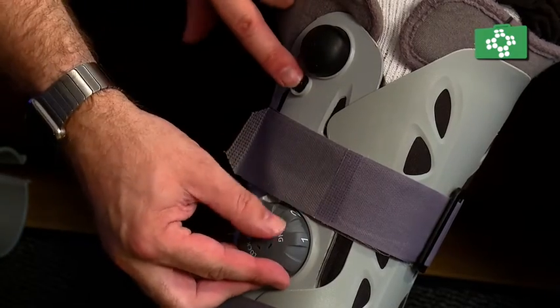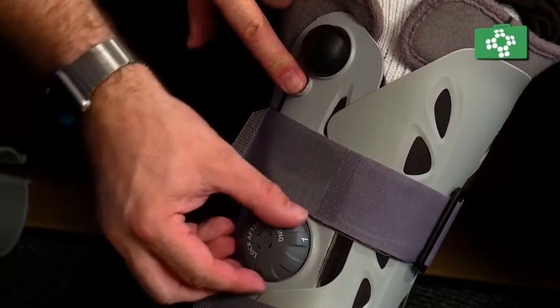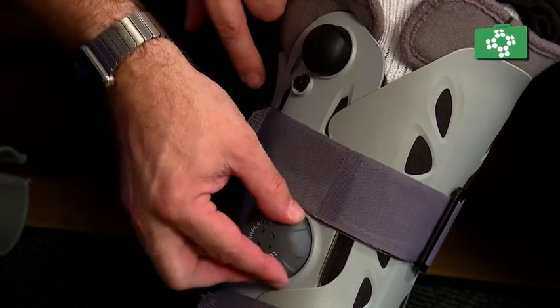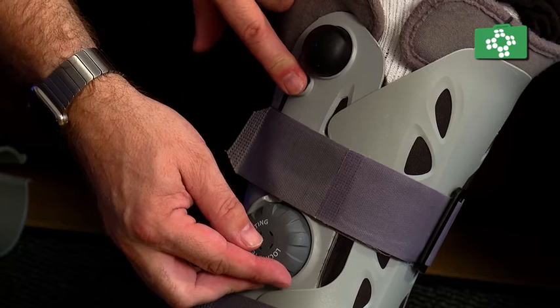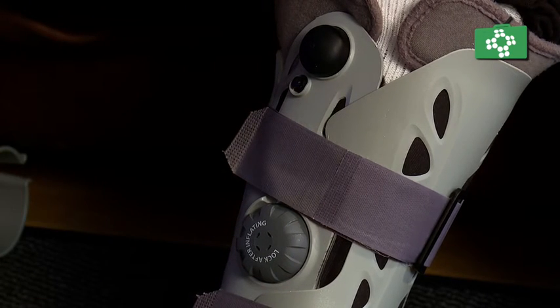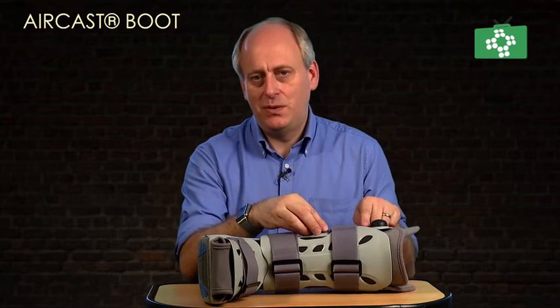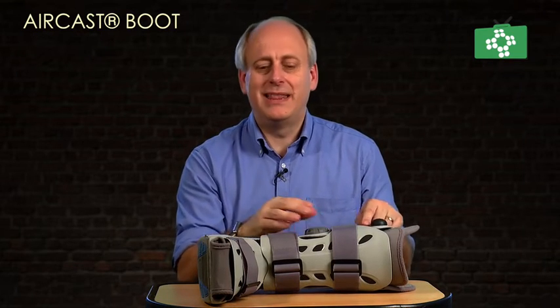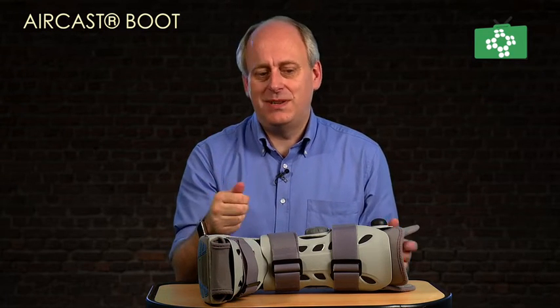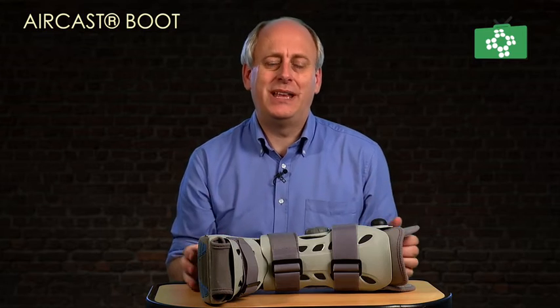Once the boot needs to be removed, just undo the Velcro and take it off. But you also need to take the air out. To do this, turn the dial to section three and push the little button — that will release the air, and you'll hear it coming out. Then move it to two and push the button, then one and push the button. Now all the air chambers are empty. If you forget to let the air out, you can just squeeze the air chambers with your finger on the button and all the air will come out.